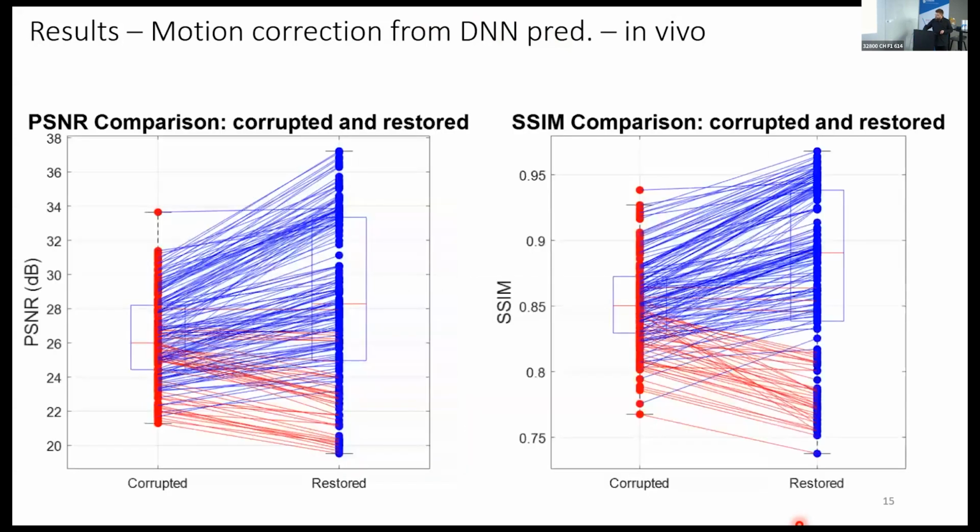And here we show the PSNR and SSIM for the in vivo acquisitions. Of course, we don't have the true reference because it's not simulated.